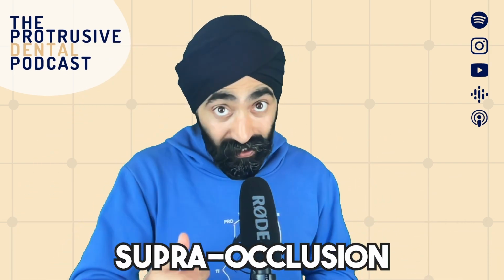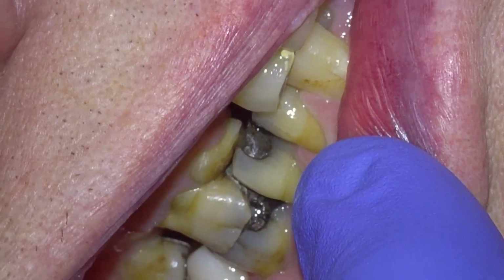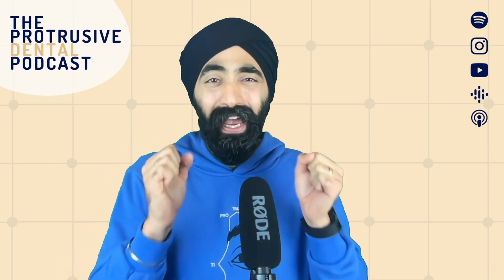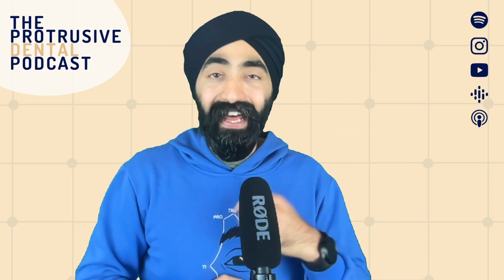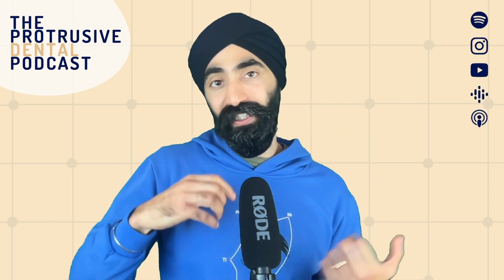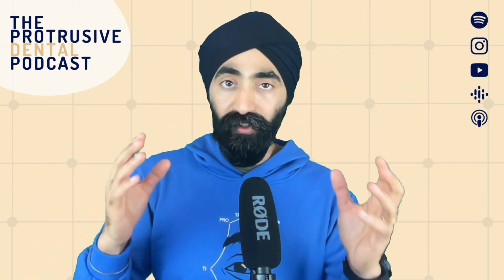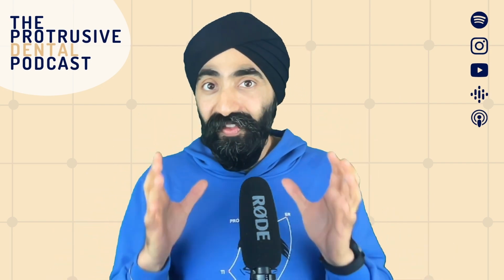It's going to need a lot of time to adjust to get it happy, both in the static, the tap, tap, tap, and in the dynamic, i.e. the lateral excursions. And sometimes it's a painstaking process where we're trying to get this crown perfect and happy in the patient's bite, and then the patient's perception comes into it. And there are those protocols that we talk about in other YouTube videos and episodes that I've done about checking the occlusion. But this episode is about how we can prevent this scenario from happening.